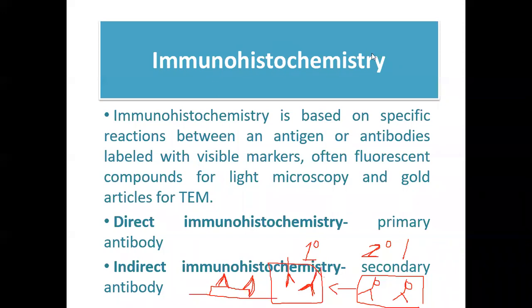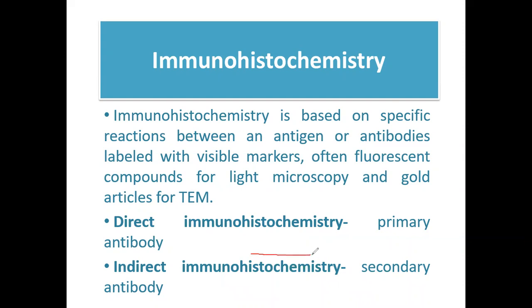So hold on. This is now your slide and this is your tissue. Okay? Guys, meron tayo nung antigen A. Ilalagay natin yung primary antibody natin. Si primary antibody, walang label. Tama? So, ibabind niya ngayon, your primary antibody is your anti-A antibody. So, it will bind now the antigen. And then after that, we're going to rinse it, wash it. That's to remove the excess primary antibody, yung mga unbound. Siyempre kung unbound sila, hindi sila nakafix sa cell kasi hindi sila nakadikit dun sa mga antigen.